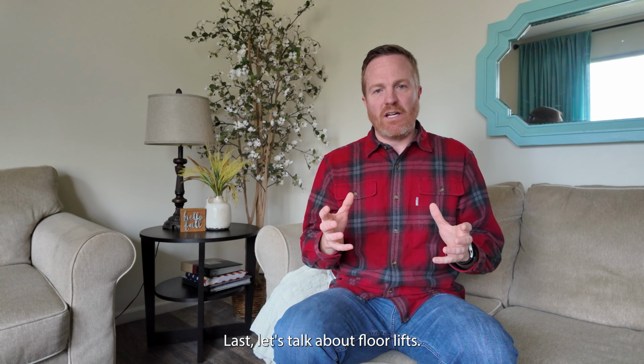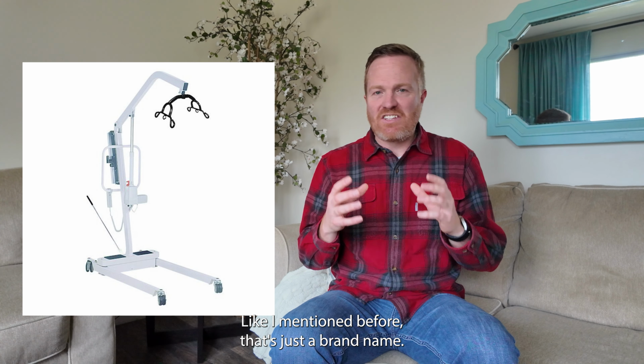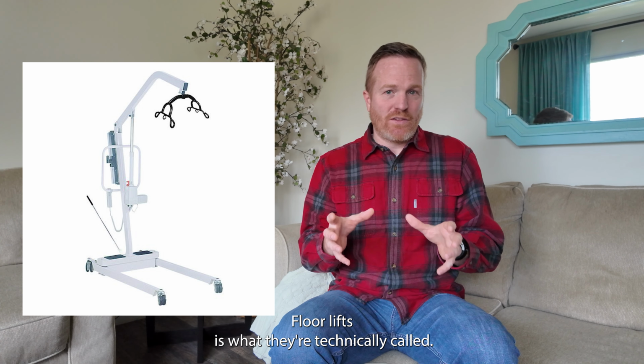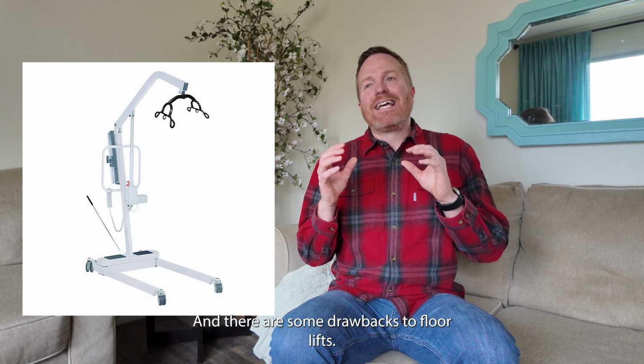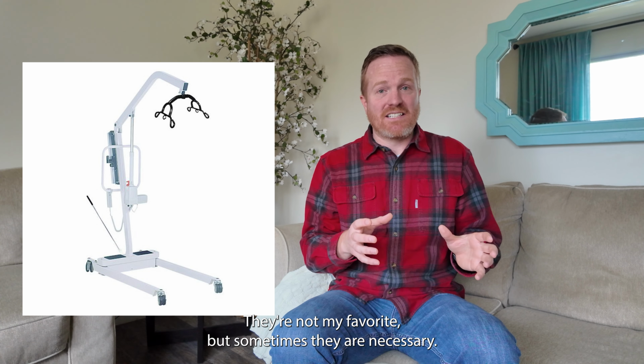Last, let's talk about floor lifts. And again, sometimes people call them Hoyer lifts. Like I mentioned before, that's just a brand name. Floor lifts is what they're technically called. And there are some drawbacks to floor lifts. They're not my favorite, but sometimes they are necessary.